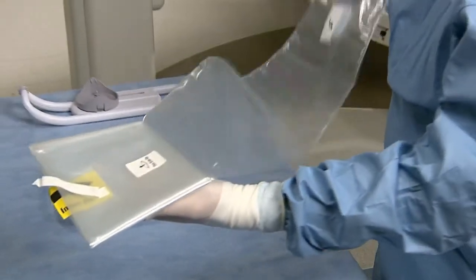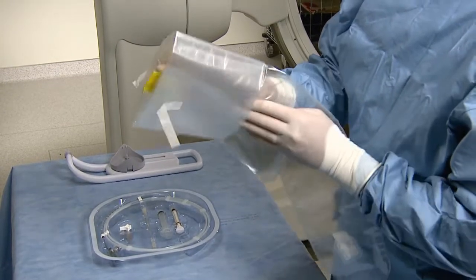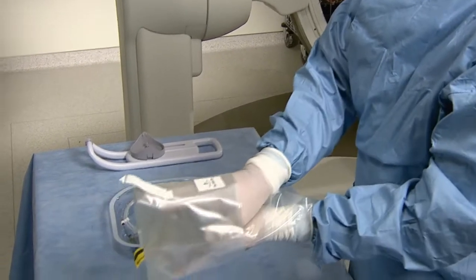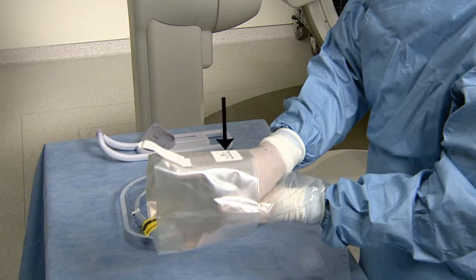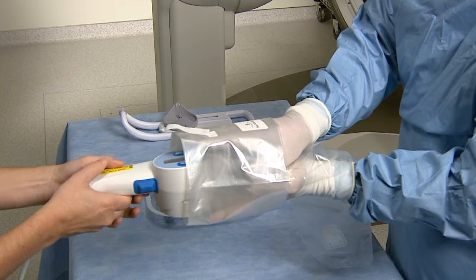The sterile operator unfolds the bag so the faceplate is on one end and the Insert Here sticker is on the other. Note that the This Side Up sticker is facing toward the ceiling. The non-sterile operator places the motor drive into the innermost fold of the bag at the Insert Here sticker, with the motor drive faceplate pointed toward the ceiling.